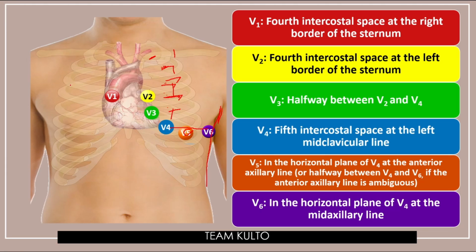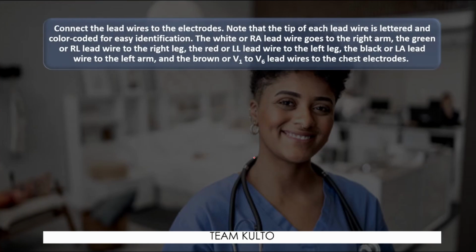Ito nga po. So, V1 to V6. Malinaw yon? Screenshot mo na, baby, kasi magpo-proceed na tayo. Okay. Now, ito pa mga additional information mo ha.